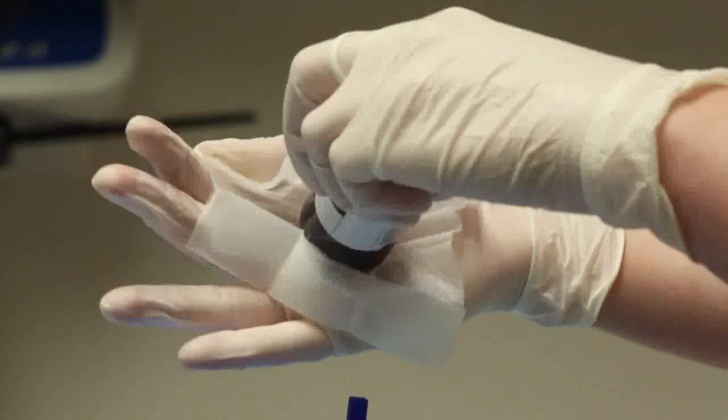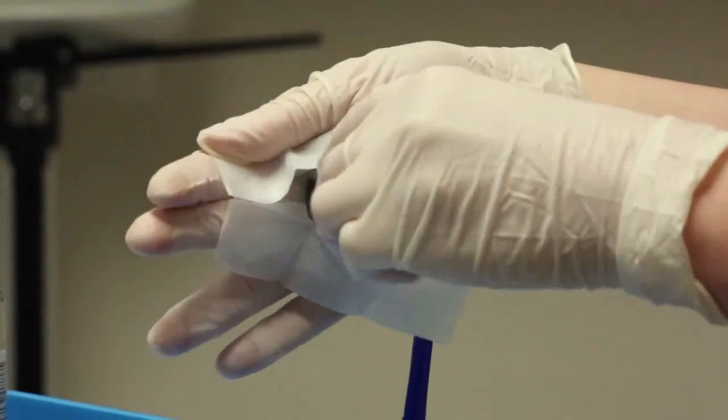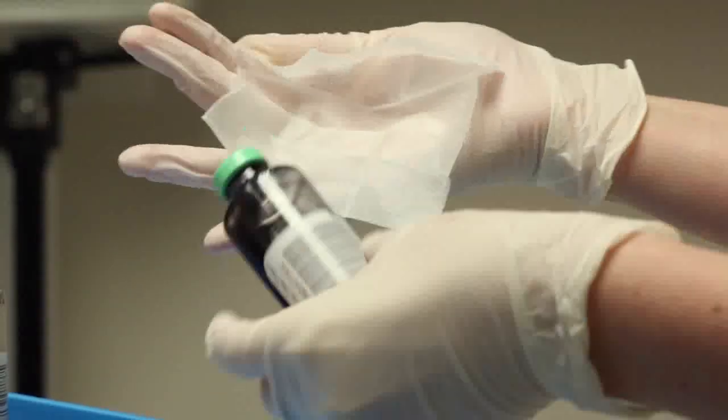Present the bottle top towards the center of the wipe and scrub the top for 20 seconds, using a few different parts of the wipe. It is imperative to create friction and to allow the bottles to dry before use.